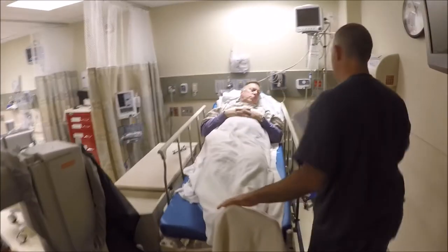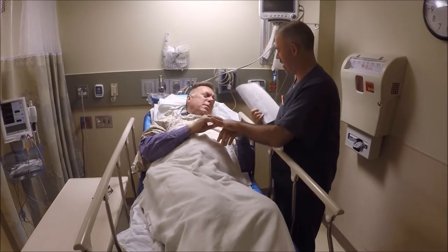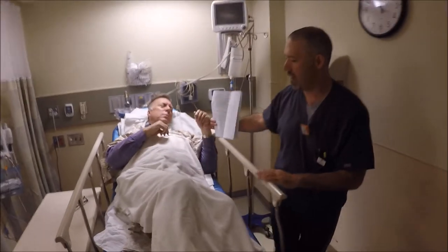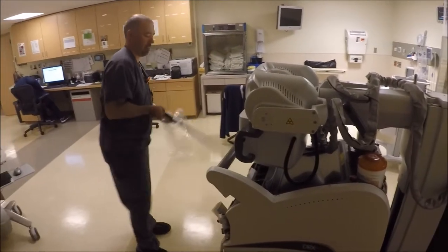Okay. Hello. Hi. We're going to get a quick chest X-ray on you here. Let me see what's here — take a quick peek. You just need to try to relax. So let me get the cassette ready. I know there's a lot of stuff going on.